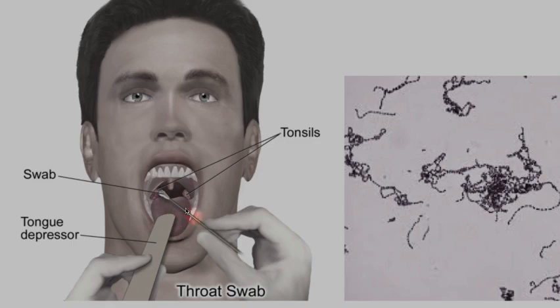And also you don't touch the cheek or the teeth because they contain the normal flora, the undesired microorganisms. So you keep your swab limited to the tonsil areas and wherever there is redness or suppuration.